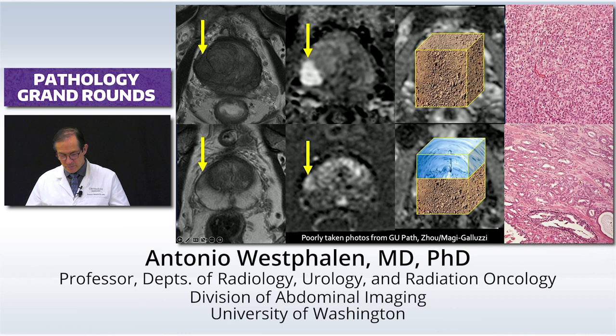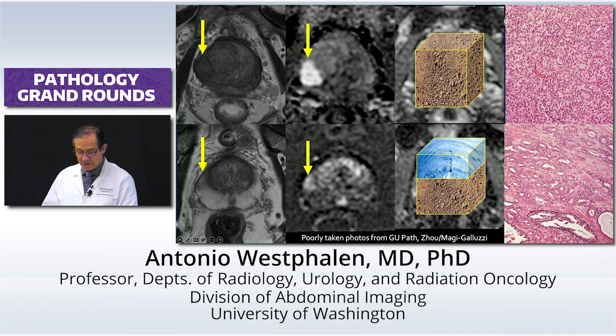To make it a little easier to understand what we're looking at, maybe there are some cells that are somewhat abnormal, and we still have some glandular forms there. You have normal glands and stromal tissue, while on the other one, you only have this blob of cells, a block of abnormal cells. When you average the normal tissue, the abnormal glands, inflammation, and maybe some calcification too, all these things will average. This is what we usually see, the more common thing, and that's why things oftentimes are not very obvious. Again, this will have an impact later on what we need to do. But as people say in medicine and love, never say never, never say always.